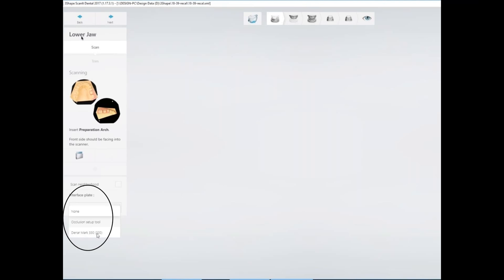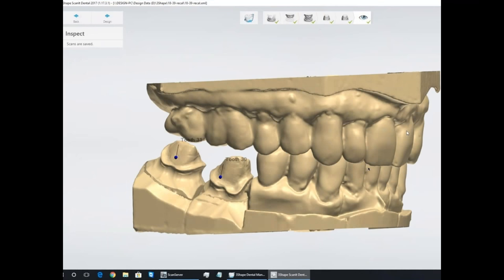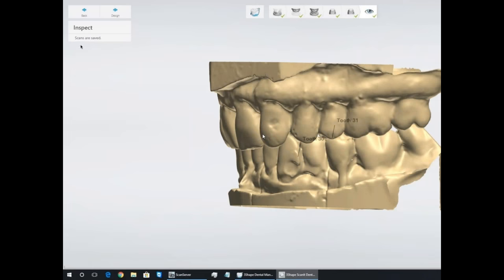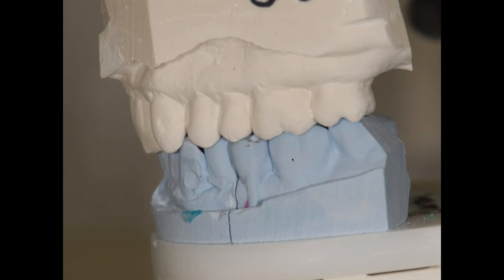All you have to do while scanning is when you first start, you'll see the interface plate option — click down, pick the calibration file you created, and proceed. Even though it shows the occlusion icon in your process bar, you won't actually have an occlusion scan — it'll skip over it and you'll just be magically aligned at the end. But do not trust this at least until you've gone through a couple cases. I do 2D cross sections where I know I've got contact, check those out, and compare what I see on screen with what I see on the articulator.